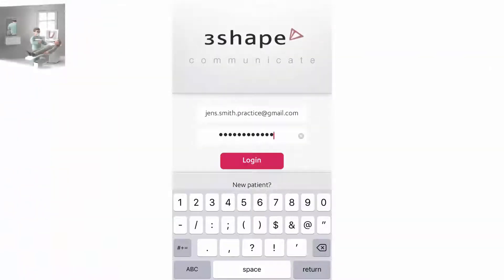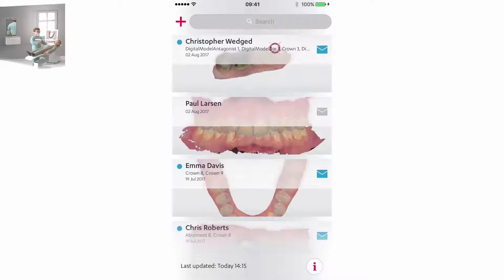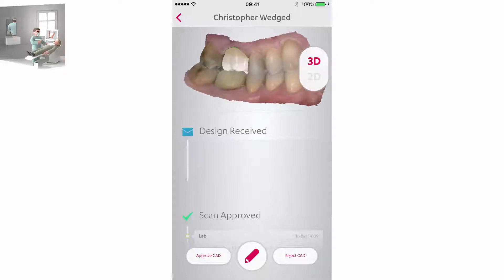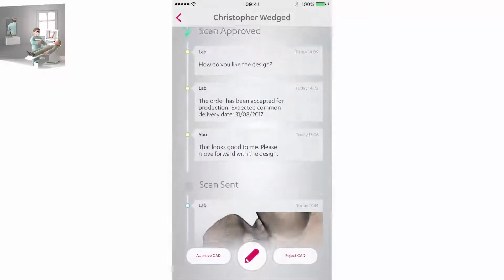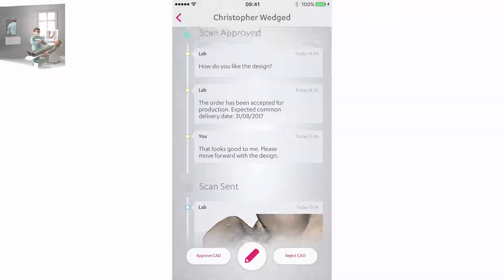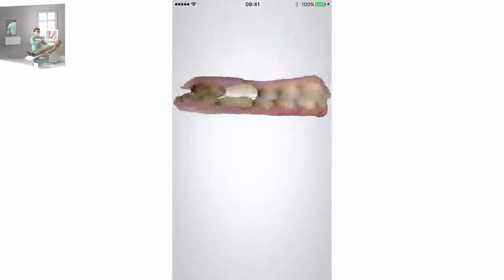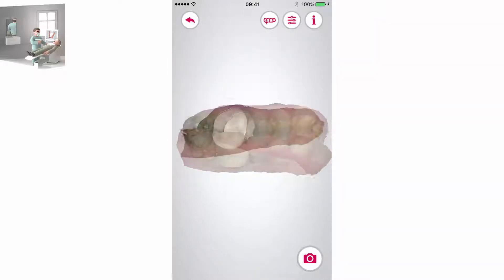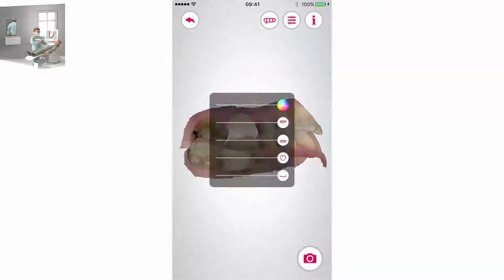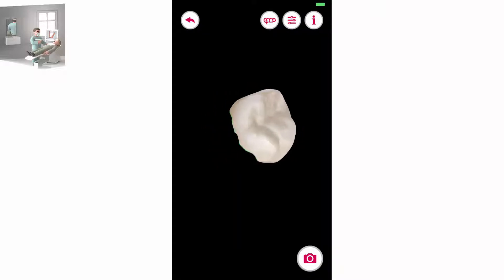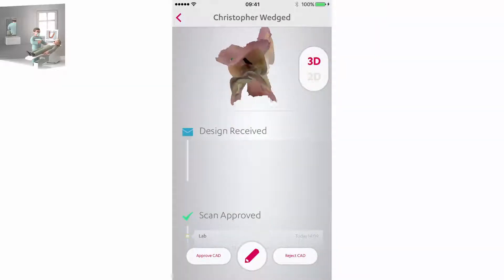The dentist logs into his account and can check the case status. There is a new status uppermost in the case history: design received. You can also review previous statuses and comments from the beginning using case history. When you touch the scan in 3D view you will be able to have a more detailed look at the design and its elements. Note the new slider which disables or enables the visibility of the crown. The button on the far left enables a black background instead of a light one.